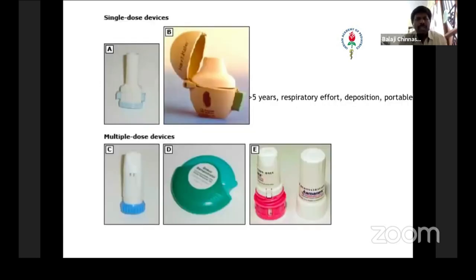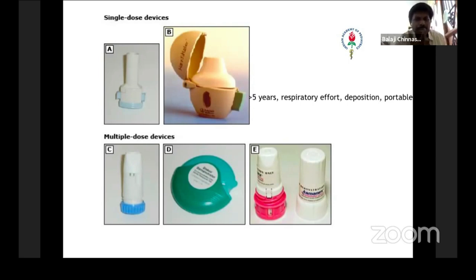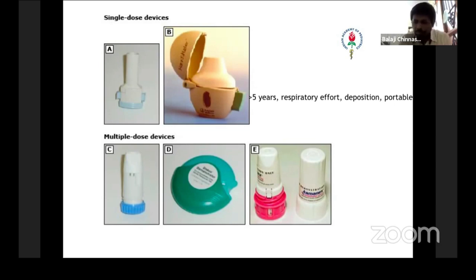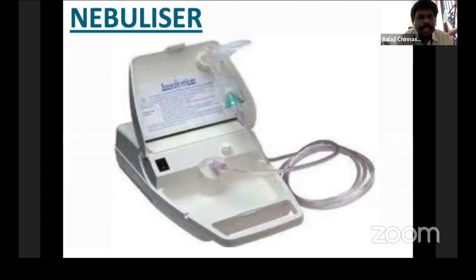You also have dry powder inhalers, where you have capsules of drugs which get broken in the device. The issue is that these are only possible for children more than five years, as you need a good amount of respiratory effort. These drugs can get deposited as powder and can cause candidiasis. The advantage is that it is a portable device — you can put it in your pocket without needing a big spacer. It is comfortable and portable. A nebulizer is also used to deliver salbutamol and steroids. The advantage is that if the child is very sick and cannot have its own inspiratory effort, the nebulizer can deliver medication.